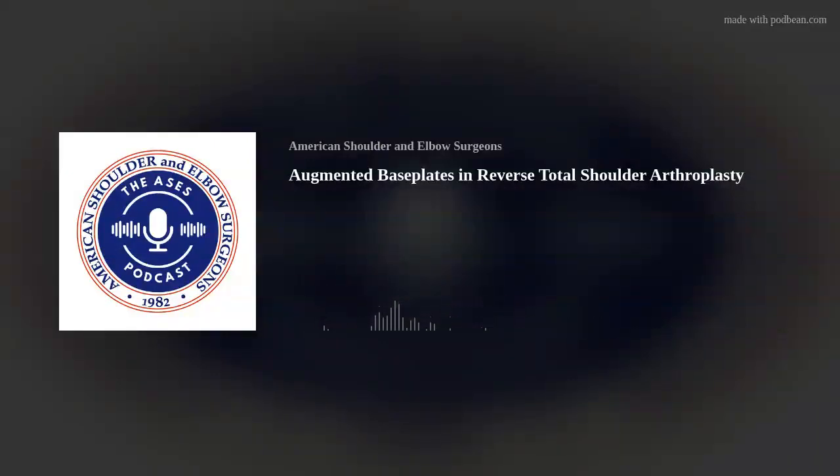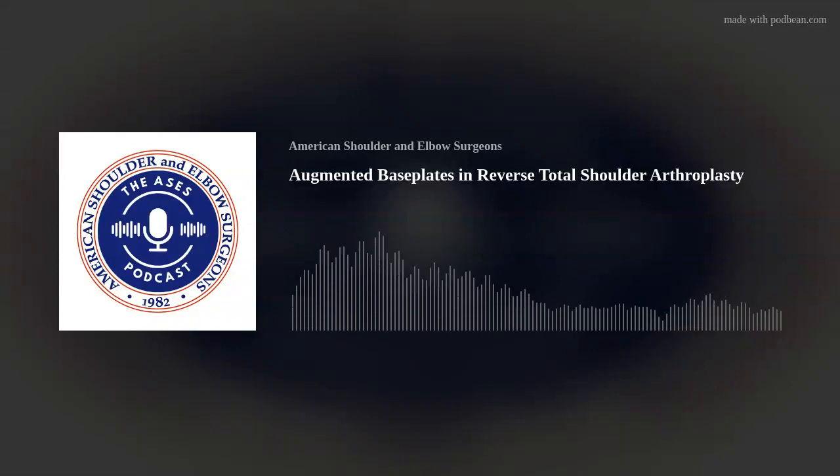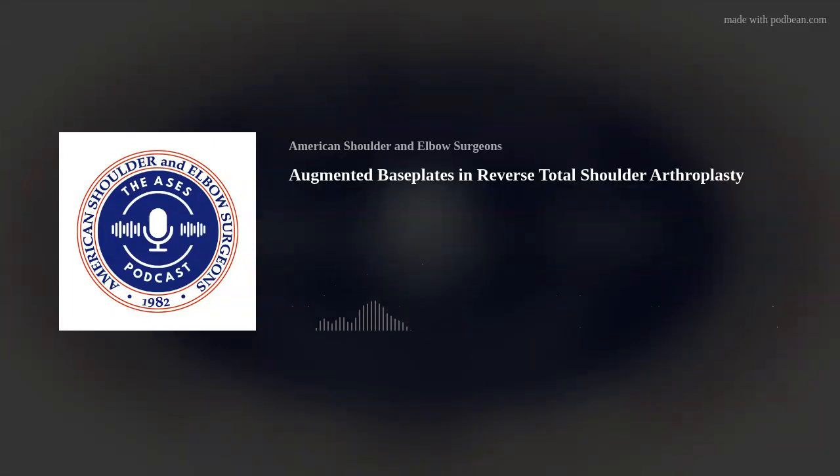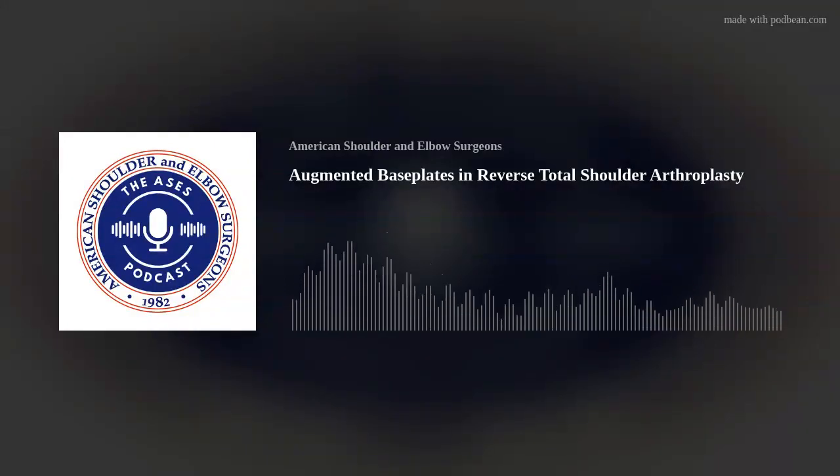And Mark talks about sounding it out, using a drill bit to sound out to make sure you're going to the opposite cortex and getting bicortical or far cortex penetration, if you're using a screw-in type baseplate. I haven't used it with a non-screw-in type baseplate, so I think you have to have a relatively monoblock system to make this work. And I think with this system, if you have at least 50 to 60% coverage, you're pretty good.